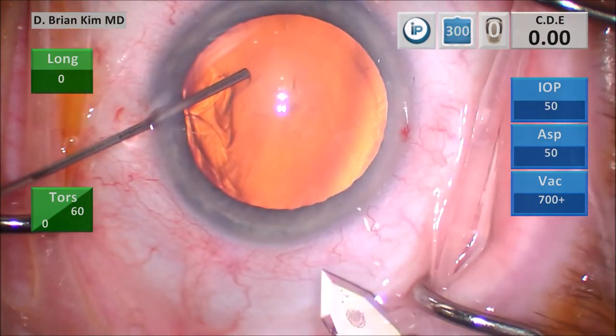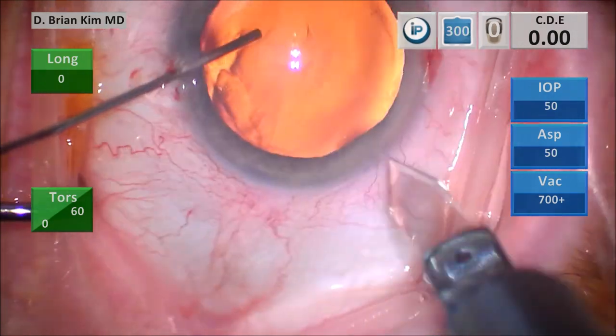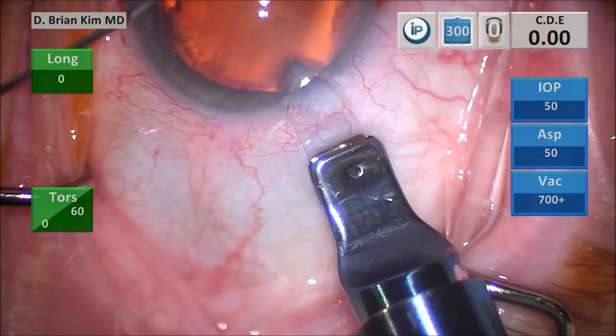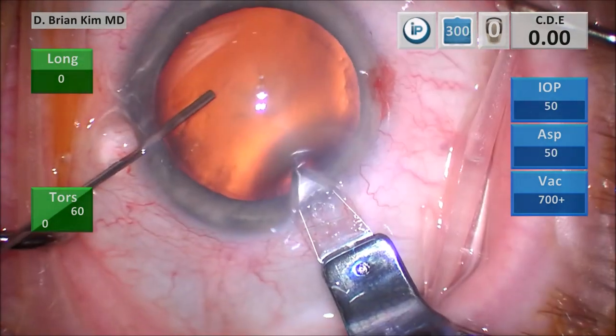I'm going to do my triplanar corneal incision. I make a vertical groove, place the blade into the deep part of the groove, tunnel through the cornea, and then dive down — and that's the triplanar corneal incision, made easy by using the cannula to hold the eye.